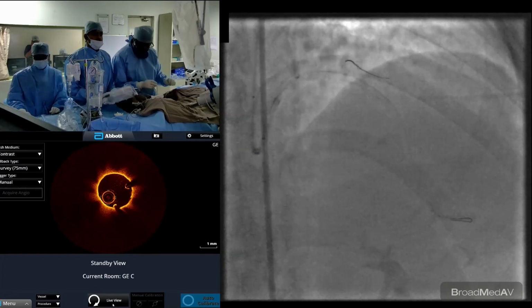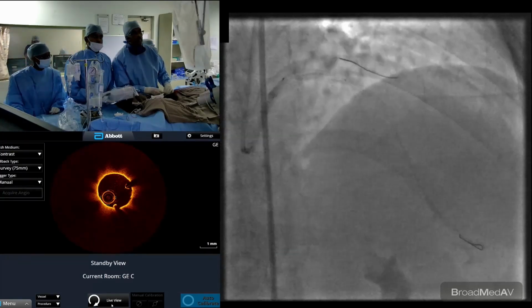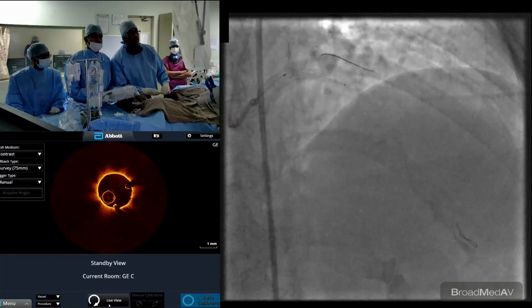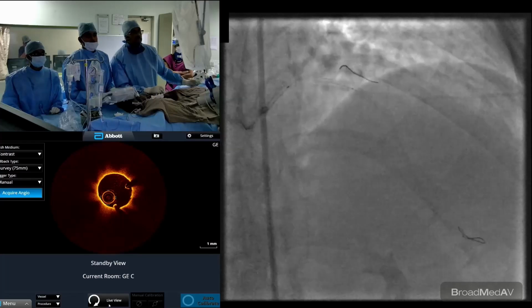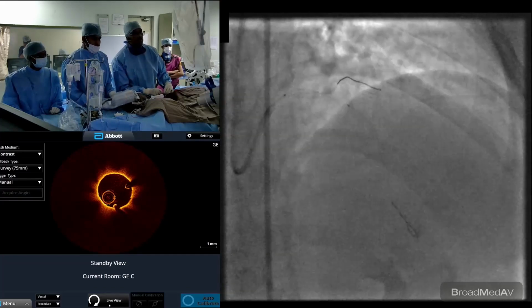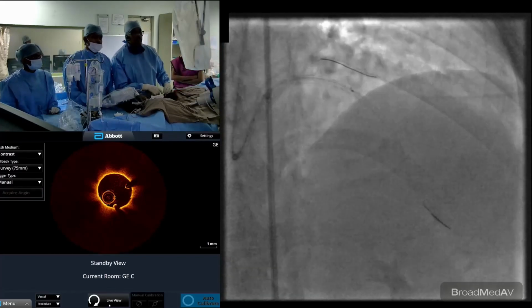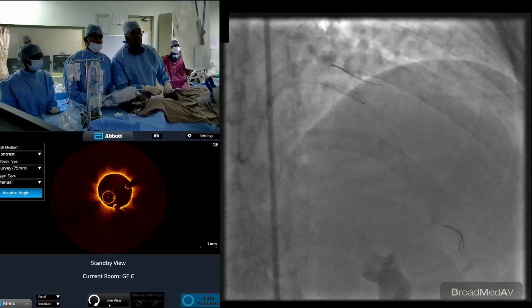See the difficulty the OCT catheter has. I think because of the anomalous LCA. Yeah, with the anomalous LCA, and the catheter becomes soft after the first few uses. So we get that out of the way. Just gently push it down. Maybe because the Z phenomenon is happening, we can push both the catheter. So what we do normally in that situation is to push both together in an OCT catheter. Once it gets used once, you get some softening of the catheter. Then you have to do this.